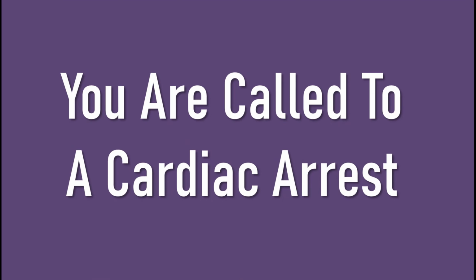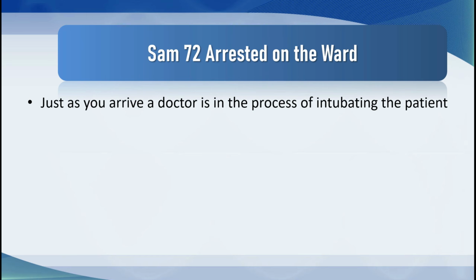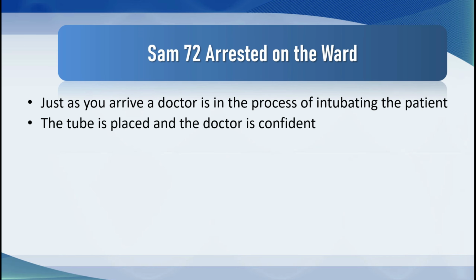Now, let's move on to capnometry. You are called to a cardiac arrest. Sam is 72 years old and he arrested on the ward. Just as you arrive, a doctor is in the process of intubating the patient. The tube is placed and the doctor is confident.